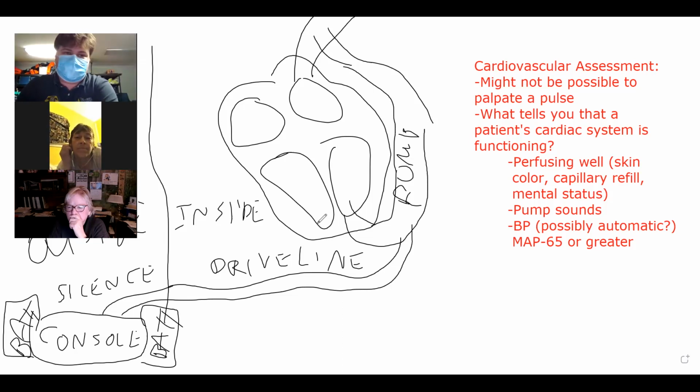Yeah, I imagine that's part of the education, right? Someone doesn't just get a motor for their body and then get kicked out of the hospital. There's a little bit of thought that has to go into this if you're taking care of yourself at home with a new piece of technology, or if you're going to be the caregiver of someone at home with a piece of technology like this. And part of that responsibility, it seems, would be to notify the local agencies that may be supplementing your care that this type of device exists in your area. And if I had any knowledge of it, I would certainly share that with all of you. I've not been aware of any VAD units in our area, however.